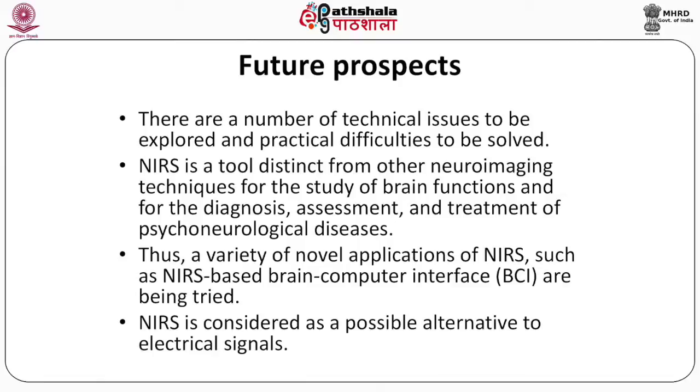So, it could be studied in those diseases which have not been explored yet. Thus, a variety of novel applications of NIRS, such as NIRS based brain computer interface, are being tried. This NIRS based brain computer interface is currently an area of research for development of this new functional near infrared spectroscopy technique. NIRS is considered as a possible alternative to even the electrical signals because it is least harmful for the body.